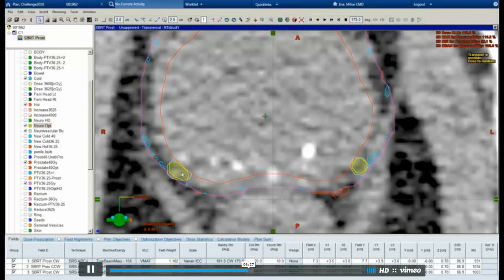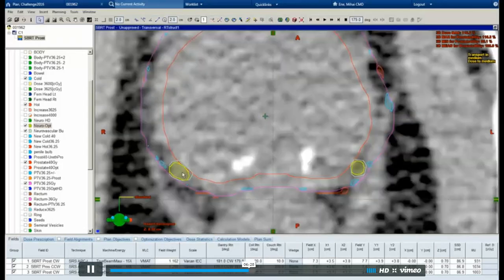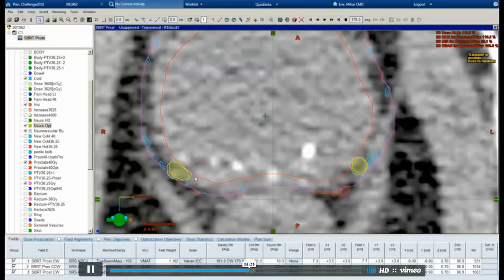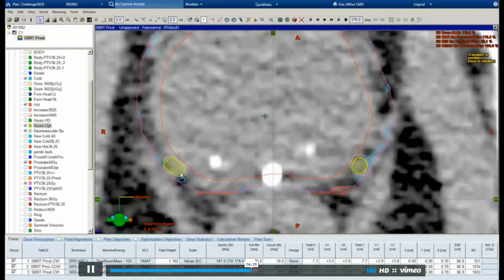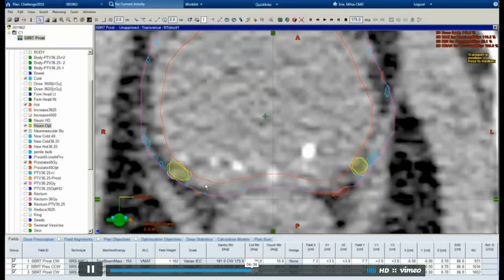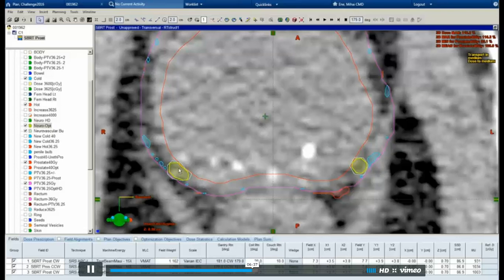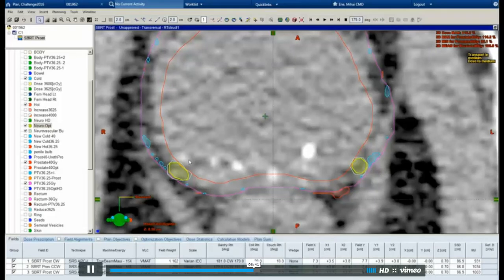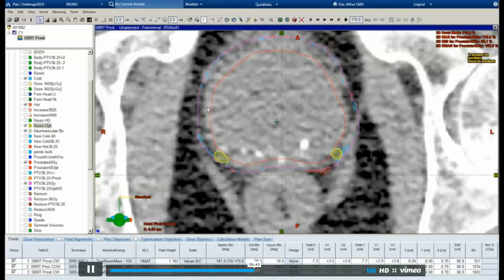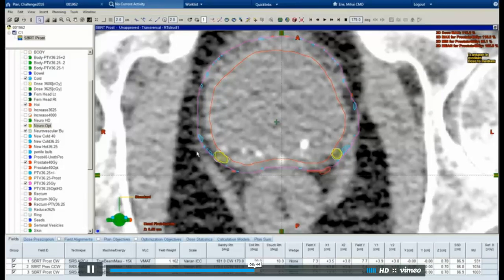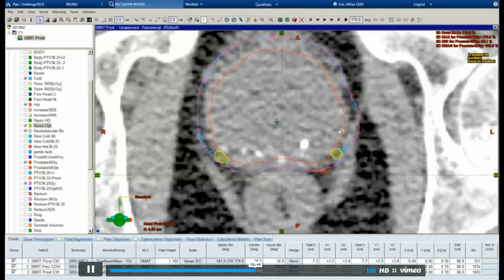What I did is I treated them as targets, so I purposely forced some dose in there. And that helped my coverage, my minimum dose within the PTV, and probably helped with the conformation a little bit. Those were not majorly helpful. I think the main thing was playing with the NTO function and repeatedly making cold and hot structures.